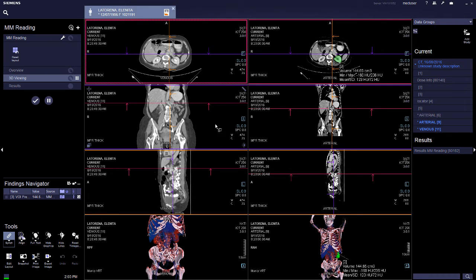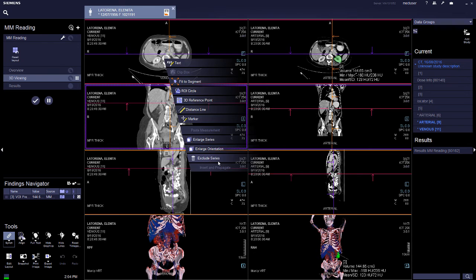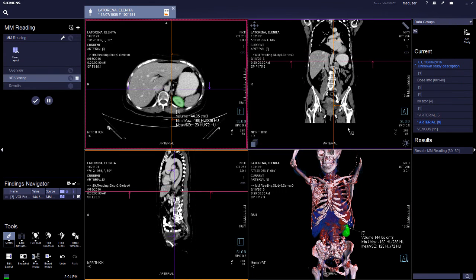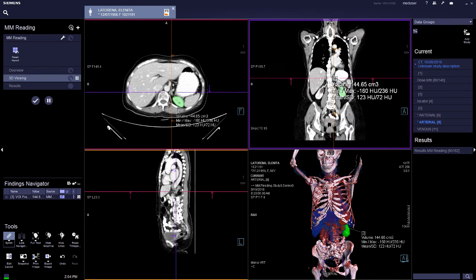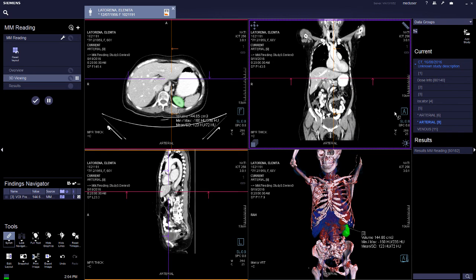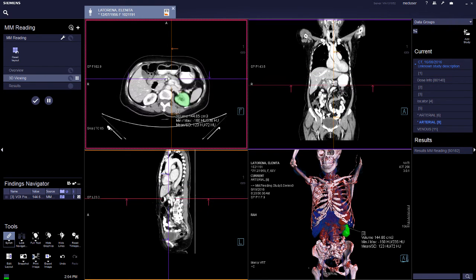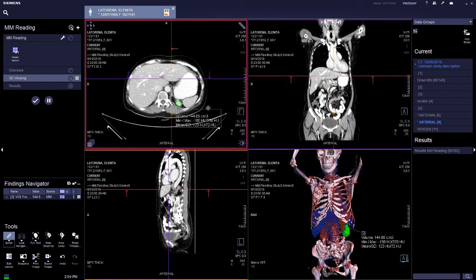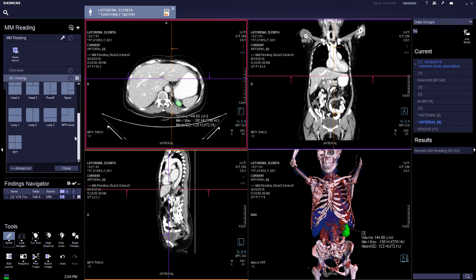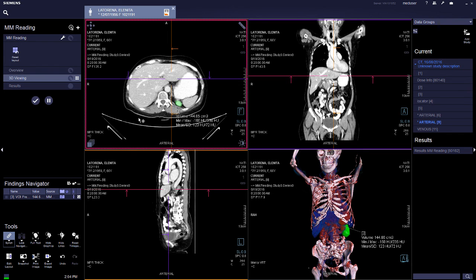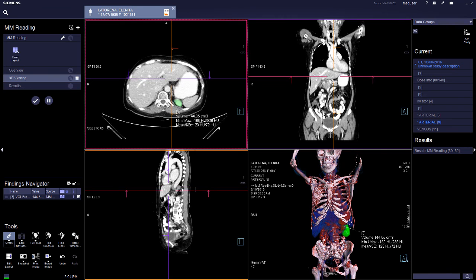If you need to exclude a series from viewing, you can right-click and select exclude series. To adjust the layout, press the layout button — under advanced you can edit the layout if needed. New layouts can also be created in other workflows, and you can also apply a shutter lock if needed.